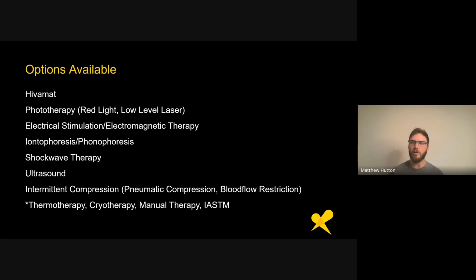Like red light, you get a little bit more broad, so you can treat it more like sun, where it's affecting tissue at the hands and the feet, for example. But low-level laser, you're putting that tiny little dot on one little body part, and you're holding it there for 5 minutes, and you're telling me that's a strong enough signal to transmit some kind of tissue healing at the systemic level or at the individual level? No, thank you.